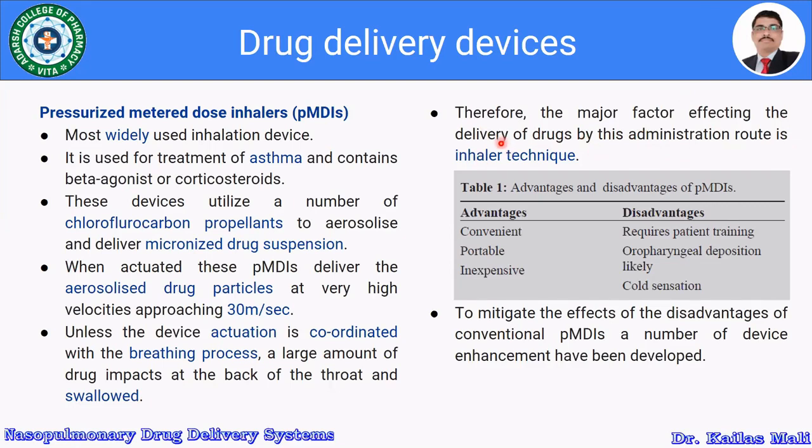Let us see the advantages and disadvantages of the pMDIs. pMDIs are convenient, portable and inexpensive. The disadvantages are that they require patient training, there may be chances of oropharyngeal deposition if the breathing process is not coordinated with the actuation, and there may be a cold sensation due to the propellants.